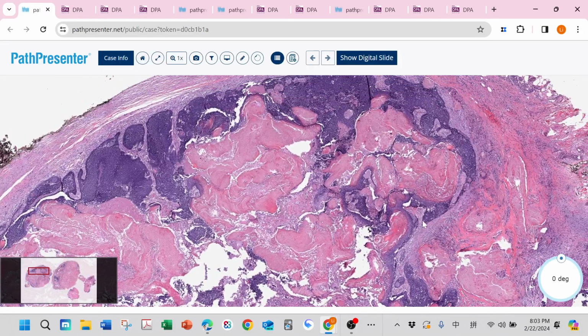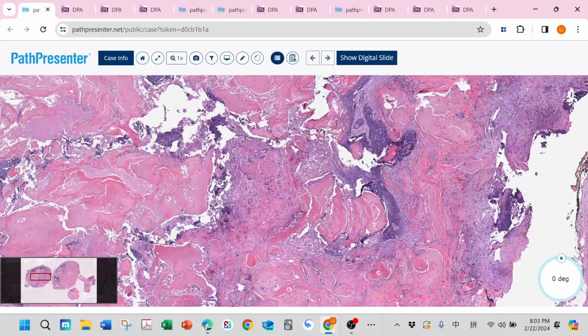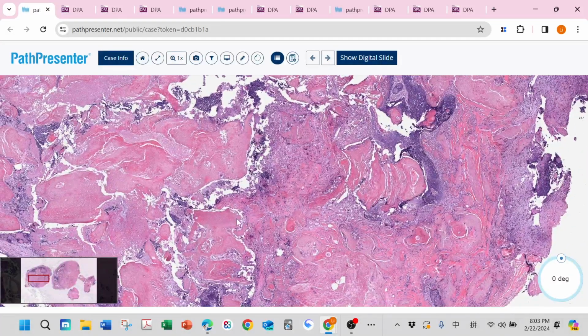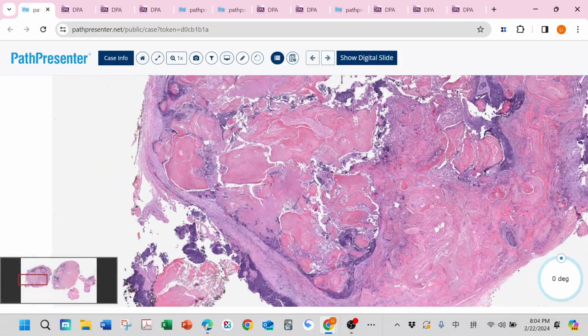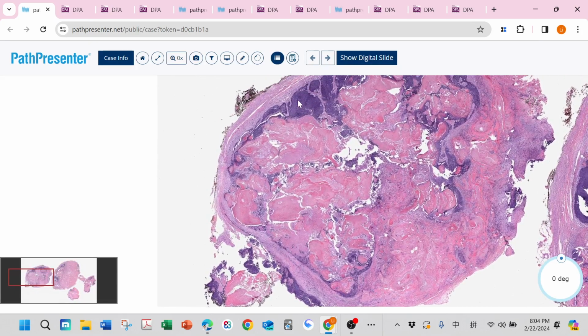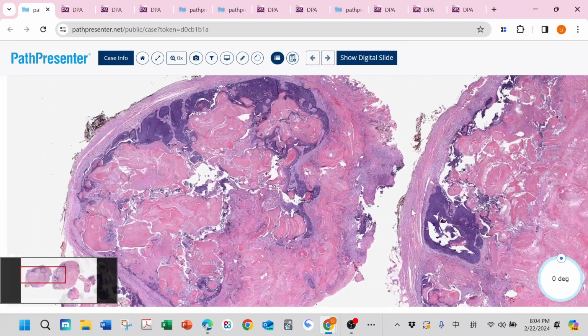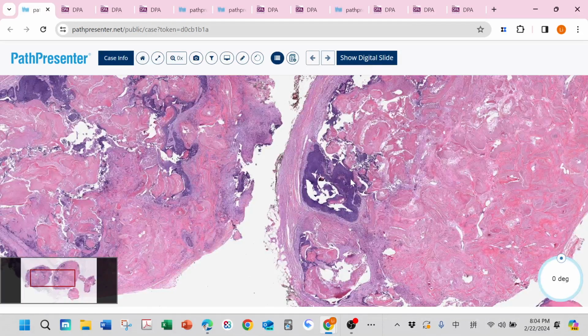bone, hyaline stroma. That one is really good for pilomatricoma, which is a benign entity. But if you see really polymorphic primitive cells, a really big infiltrative border, and cytology that is really atypical, you may also be suspicious for pilomatrical carcinoma.